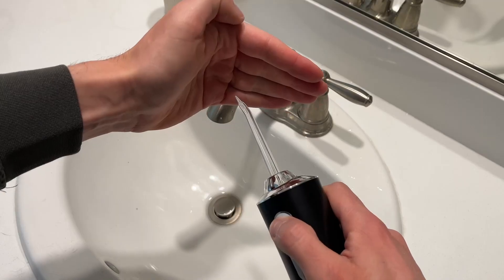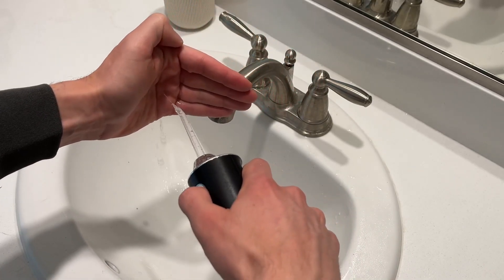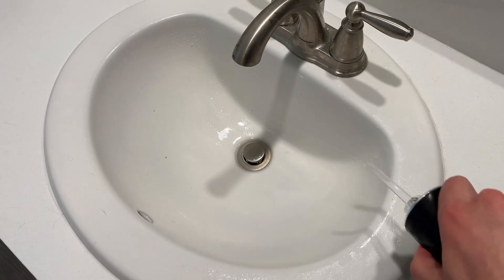There is a max fill line. Testing the stream on my hand to show its power — there is a soft setting, so if you have sensitive teeth it's best to use that first. You can see how quickly it sprays out.